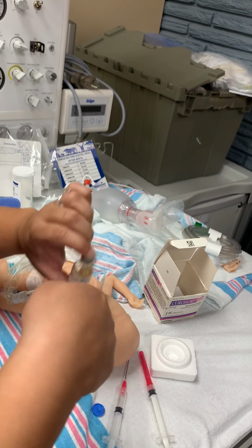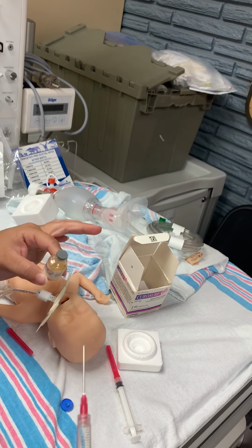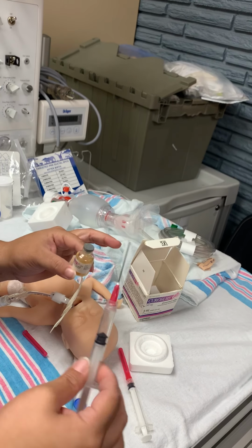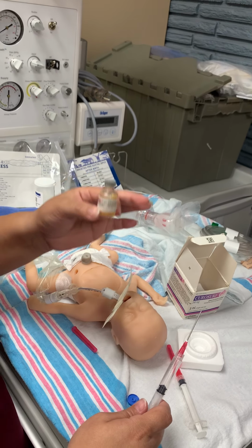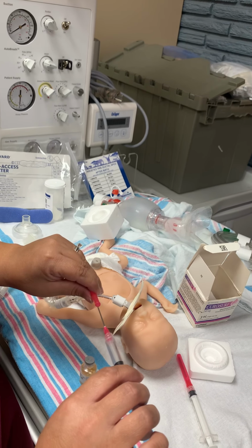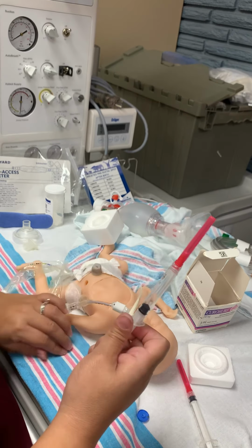So we're gonna empty out the entire contents, because for infection purposes, you don't wanna continue introducing more and more needles into the vial. This is sterile, so we wanna keep it sterile as well. So with the large bore needle, we're going to introduce it into the vial and aspirate the entire contents. There may be a little extra, so even though this is a 3 mL vial, you may get about 3.2, 3.3, but that's okay. Just take it all out. So we will pretend that like we completely aspirated the entire 3 mLs here.